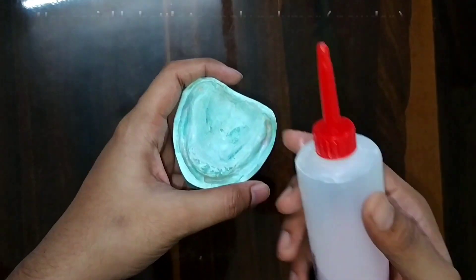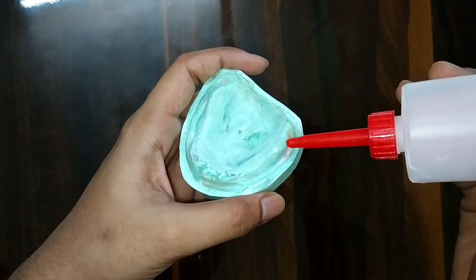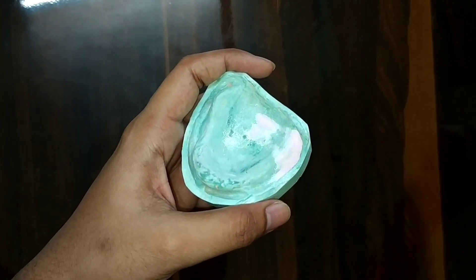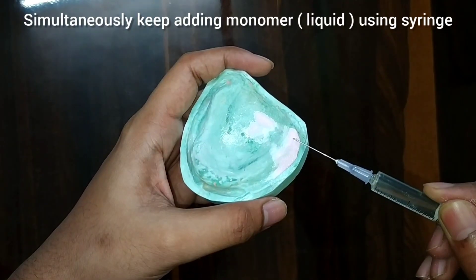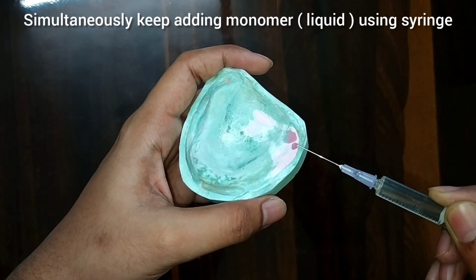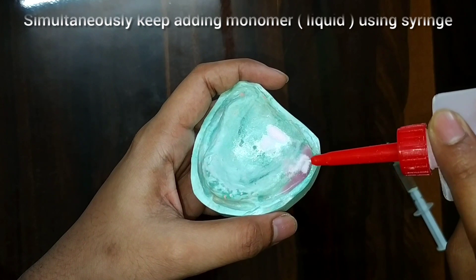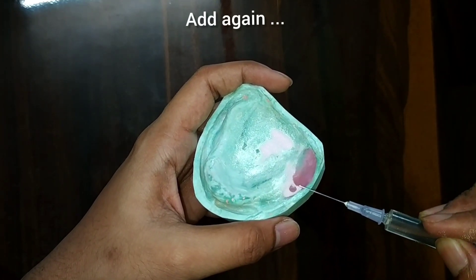After this, with the help of the sprinkler we will apply the polymer, starting from one corner. Simultaneously we have to keep adding the monomer — I am using a syringe to add the monomer. This technique is called the sprinkle-on technique.